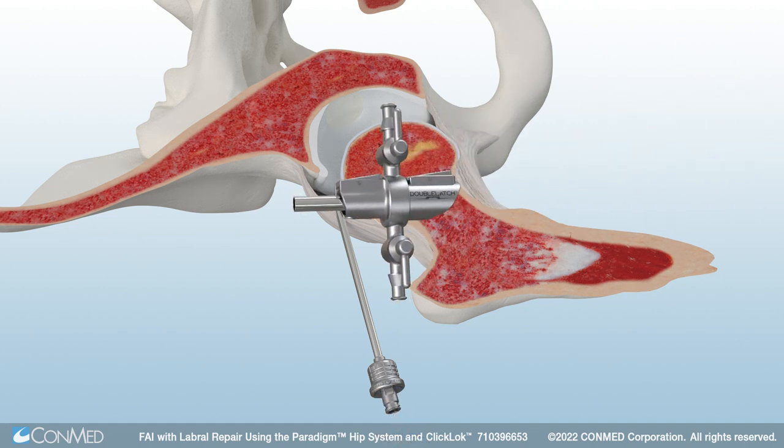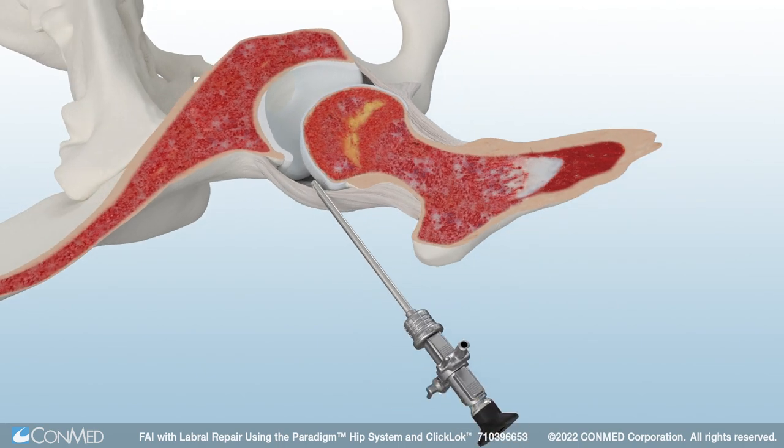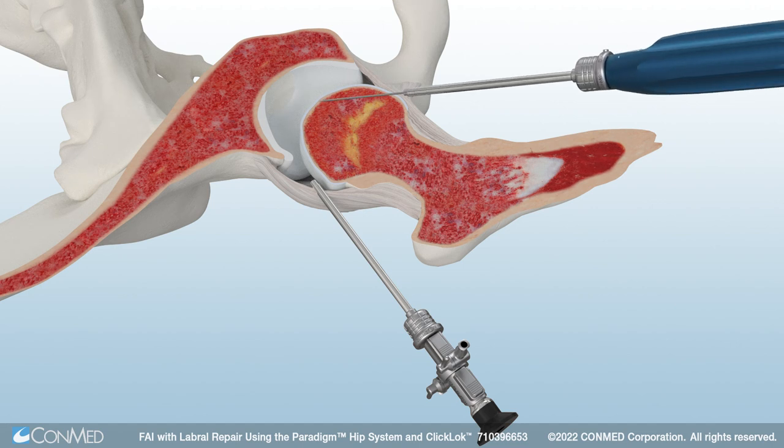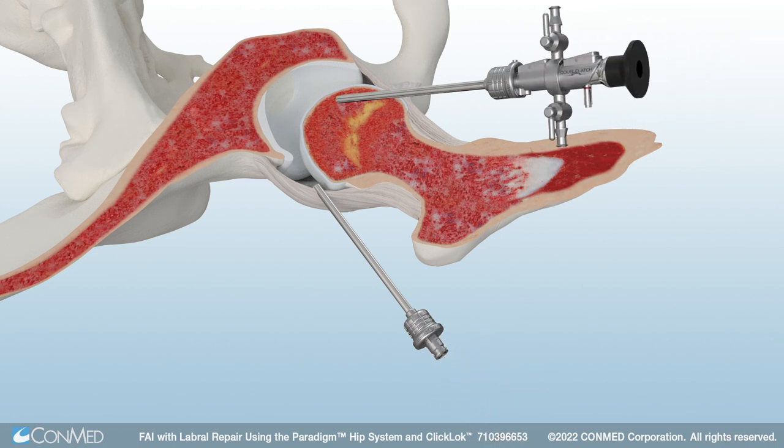The double-latch hip bridge also features Quick Connect technology to allow for easy compatibility with both the scope and metal cannula. Now the anterolateral portal is established. Use the tactile needle to create the anterior portal. Insert a guide wire over the tactile needle and then remove the needle, then place a dilator over the guide wire. A second 4.6 mm double-latch straight metal cannula is used. Now the anterior portal is established.